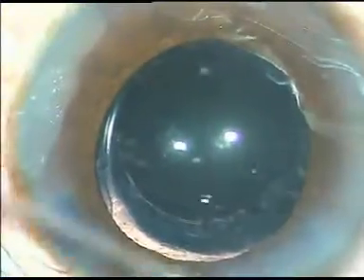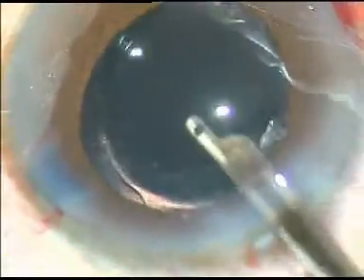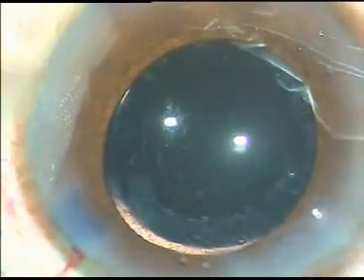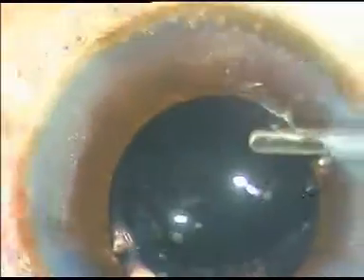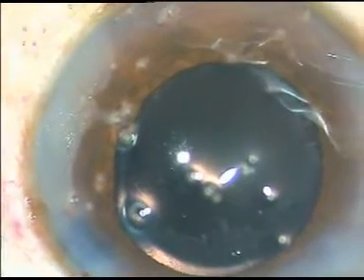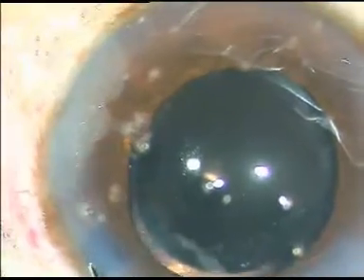This is done. Now bimanual irrigation aspiration system is taken and it is used to remove some more viscoelastic substance from the anterior chamber. Moxifloxacin is given inside the eye. The side ports are hydrated.